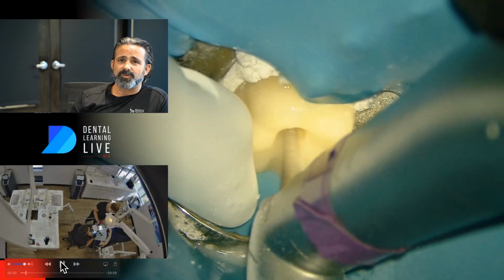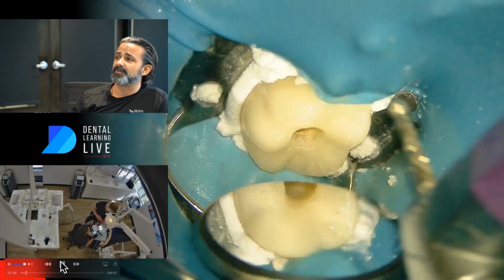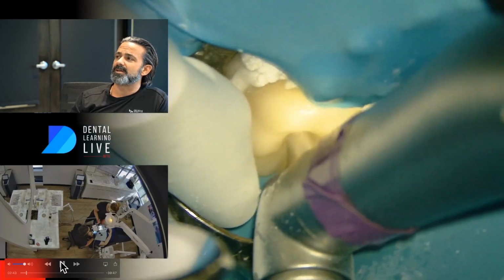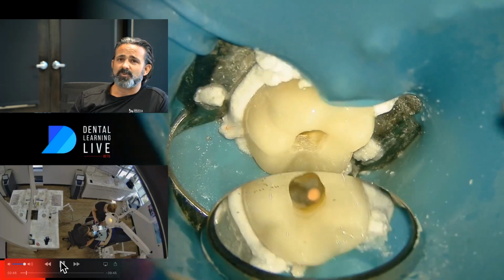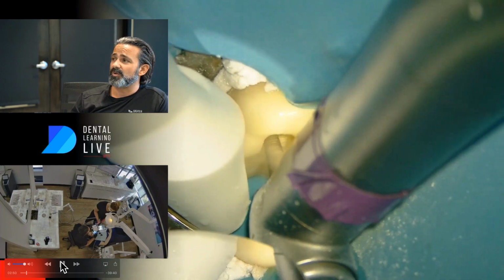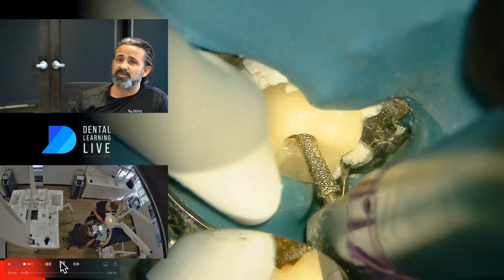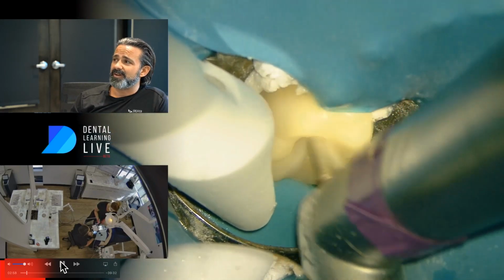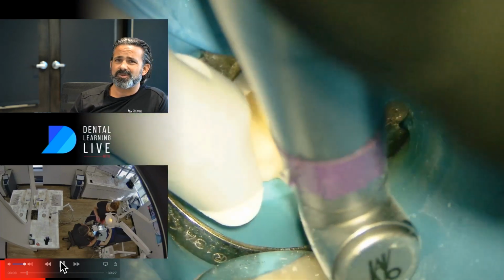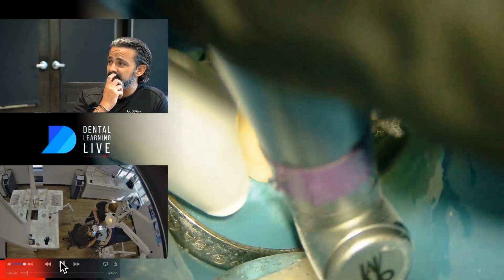One of the things when we go through a crown a second time, I'm going to be paying attention to the bond of that crown, for one thing. The other thing is I'm going to be looking at that pulpal floor really closely because I want to know what's going on. Is there recontamination going on, for instance, some sort of coronal leakage? Is there some issue coming into the root canal itself, meaning do I find corrosion products? Is it odorific? What are some of those attributes? In this one, ironically, it was fairly clean when I got in there. It didn't have an odor to it.